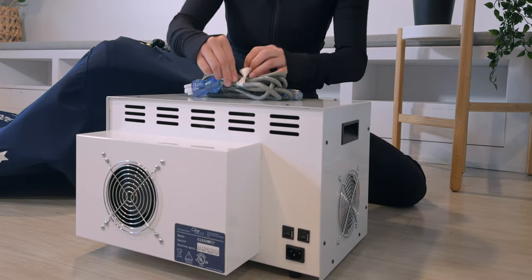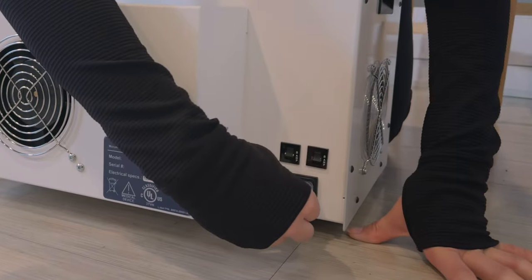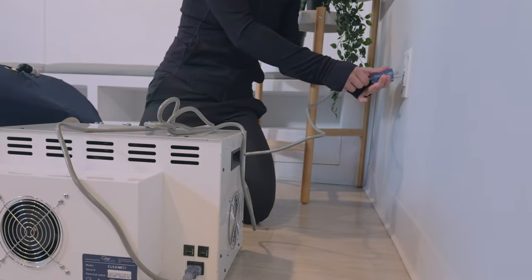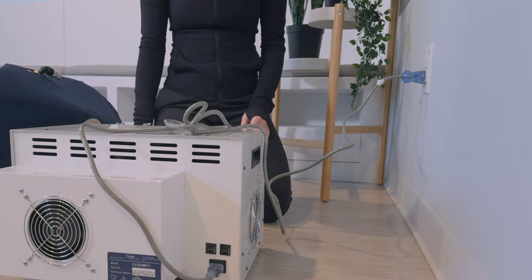Take the power cable that was provided. Take the compressor end of the cable and plug it into the slot at the back of the compressor. Then take the other end of the power cord and plug it into an appropriate outlet directly. Be aware of other devices also using this outlet to avoid overload.